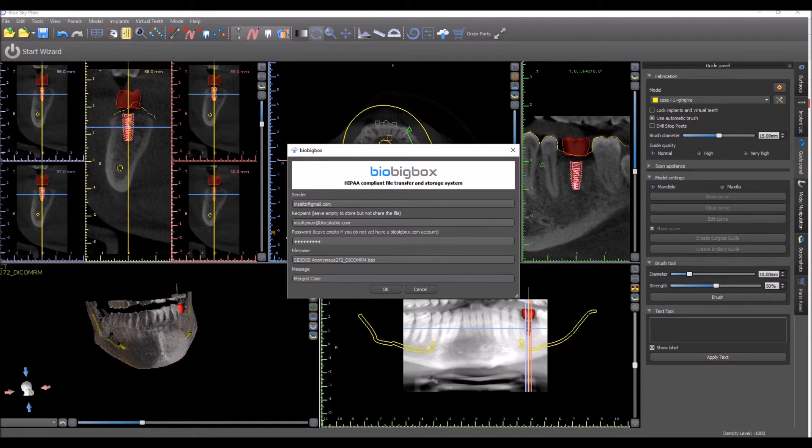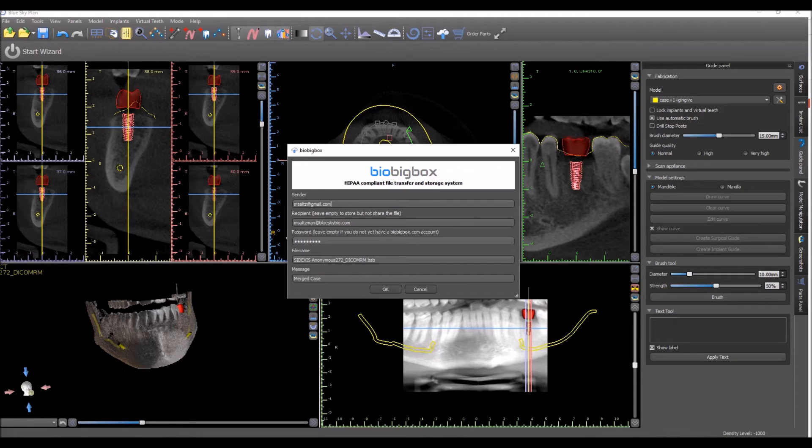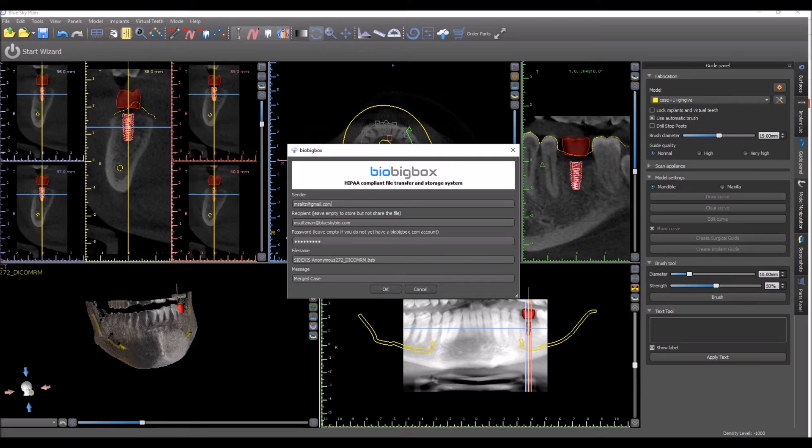Put in the email address of a recipient. This could be anybody with an email address. They don't yet need to have a BioBigBox account. They'll still be able to access and download the file that you're sending them.